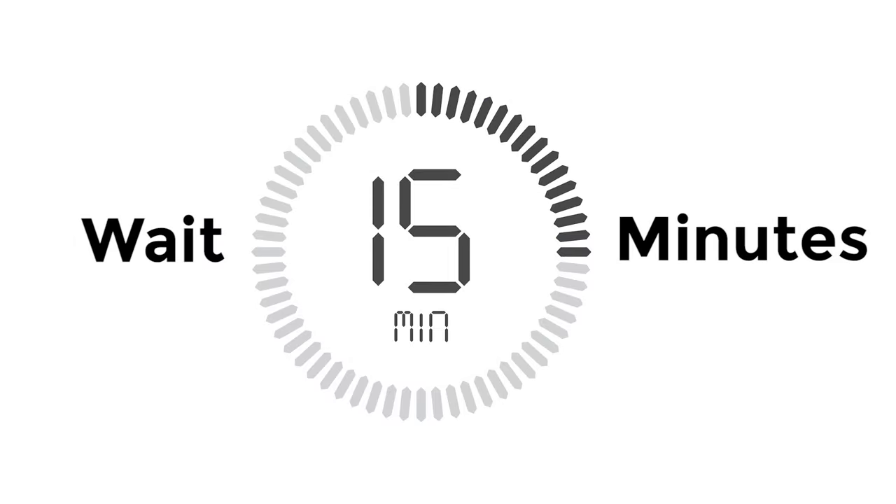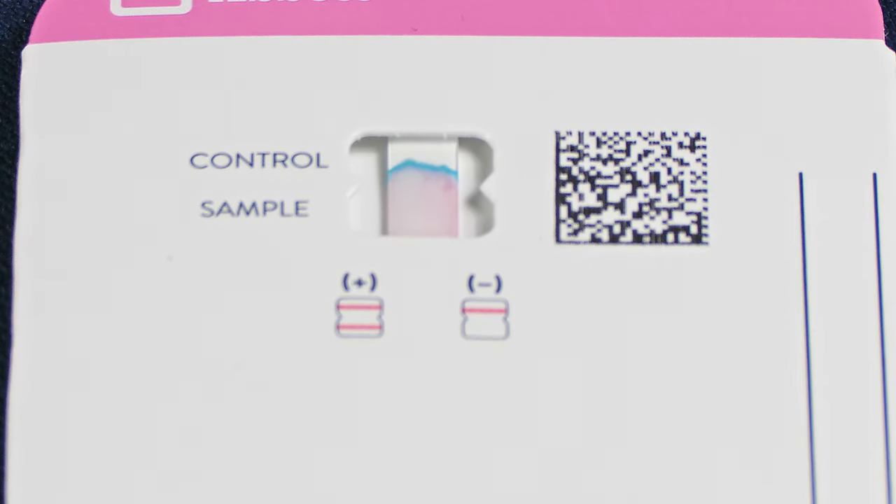Set a timer for 15 minutes. After 15 minutes, check your result. Results should not be read after 30 minutes.